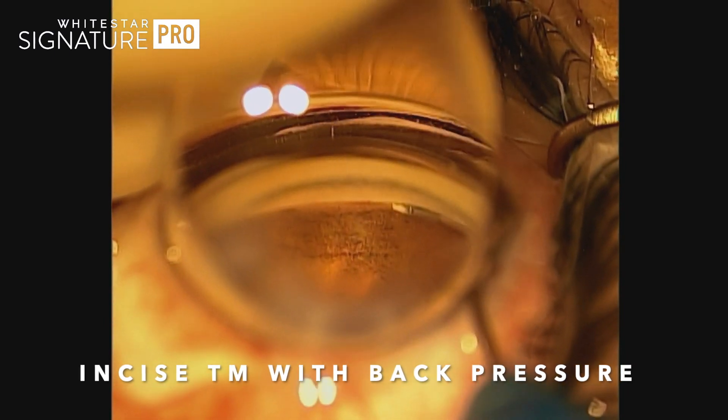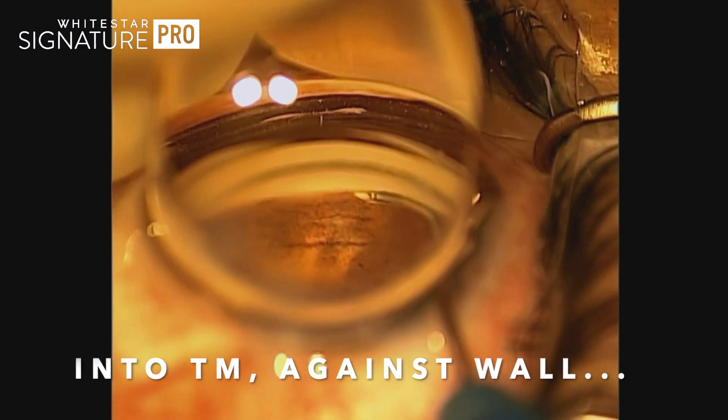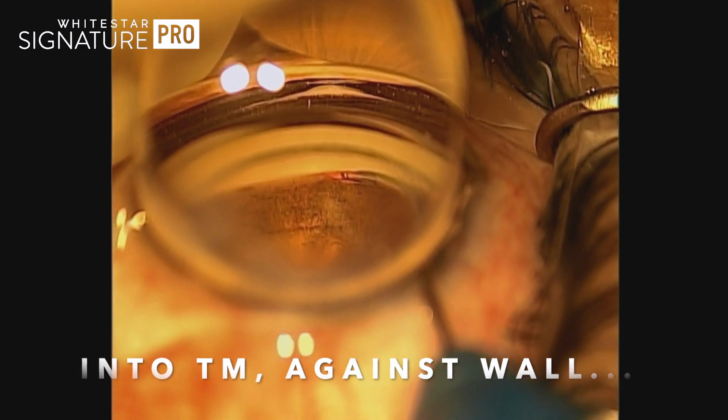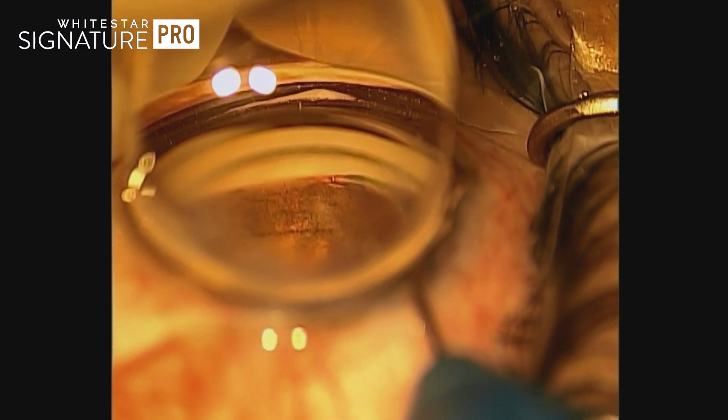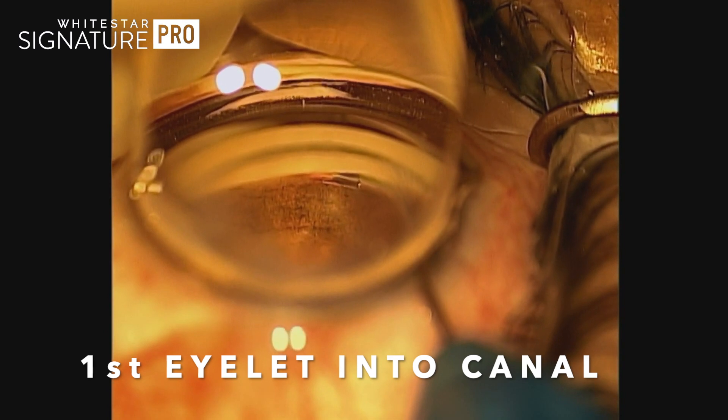It may take you a few attempts to scratch the trabecular meshwork and make sure you've got a nice little opening. Once you're confident that you're behind the TM and you've got that little scoop of meshwork, you can go ahead and put in the first eyelet.